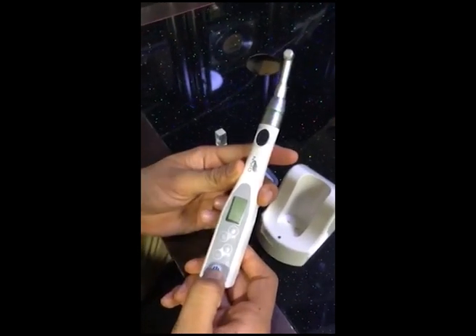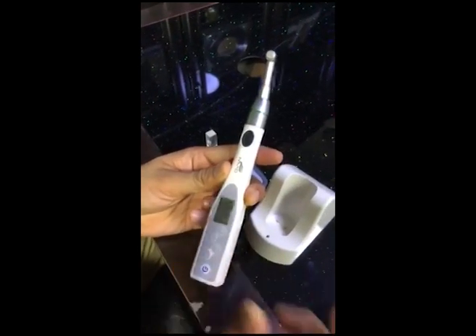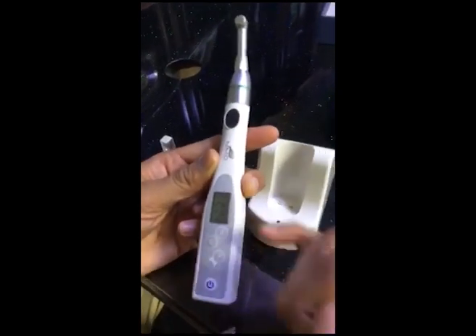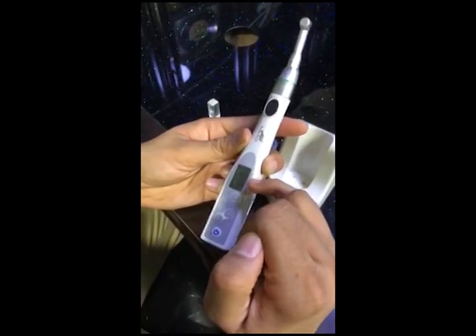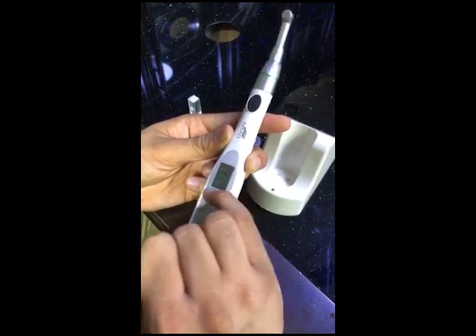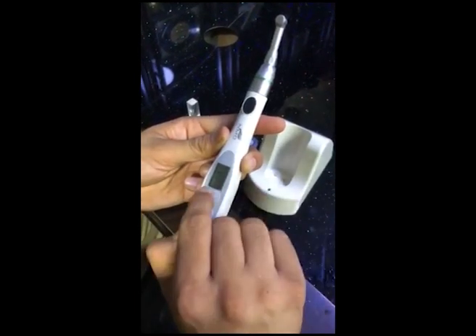Let's start with the functions. This is the power button. This is the display — it has nine programs. You can see: this is speed, this is torque, this is reverse/forward/auto-reverse, and this is the battery indicator.